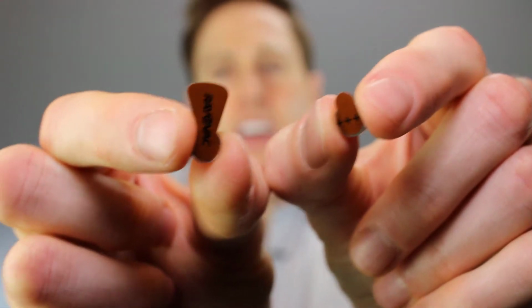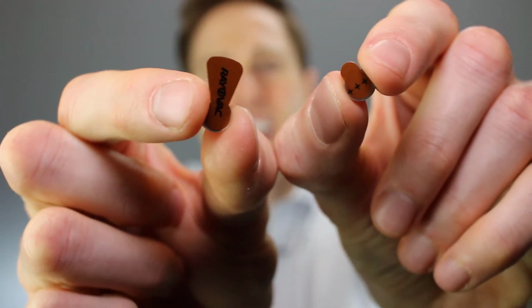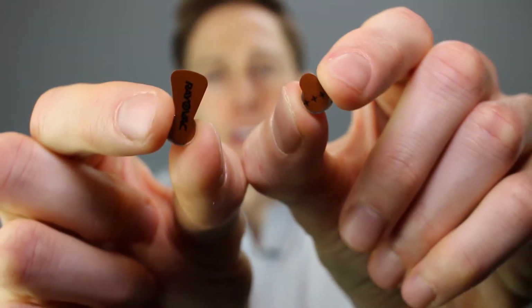The other thing about the packaging that is really nice is that they increased that sticker tab on the batteries, and they're much easier to remove than the very tiny stickers that I have from the old batteries. So when you look in terms of can you function with these batteries, if you have finger dexterity issues and you don't have a rechargeable hearing aid, you need to have a battery that is functional, and Rayovac has really figured out that they need a larger tab on their batteries to make this easier for people who need it.